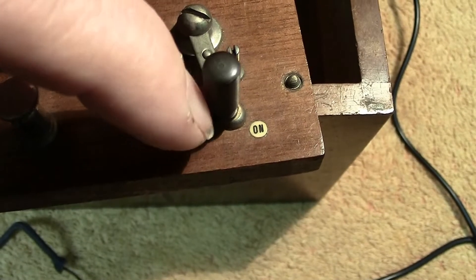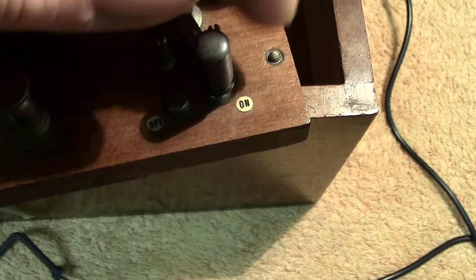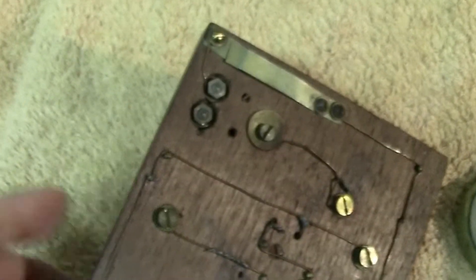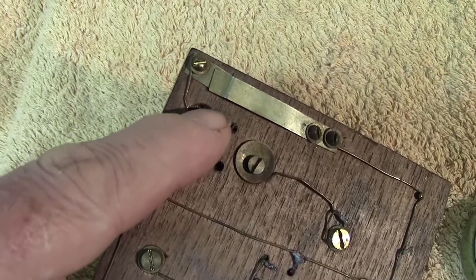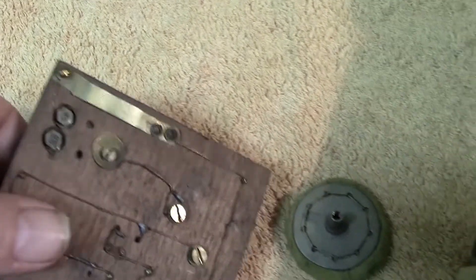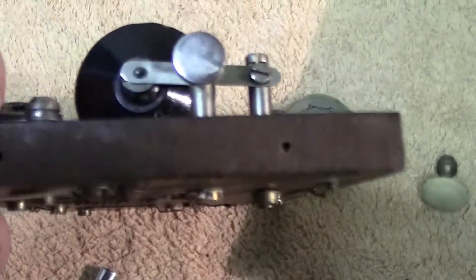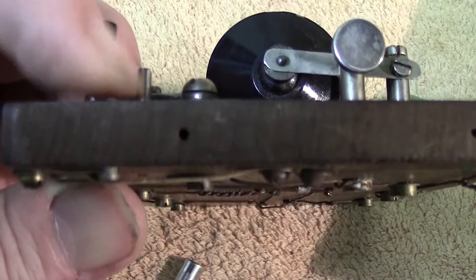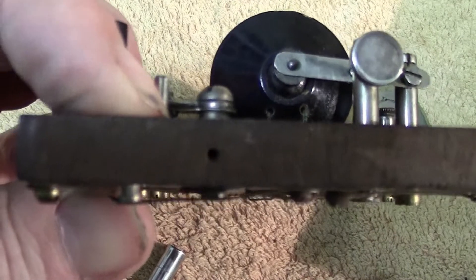You've got an on/off switch here that needs tightening up — this implement is quite a few years old, so it's entitled to become a bit worn. The two contacts go from there to one of those. When it's on, they pass it through this strip, which is simply another type of switch — a press switch. You can see a little button on the top; you press that and the circuit's broken, so it's used for intermittent use — it just makes and breaks the circuit.